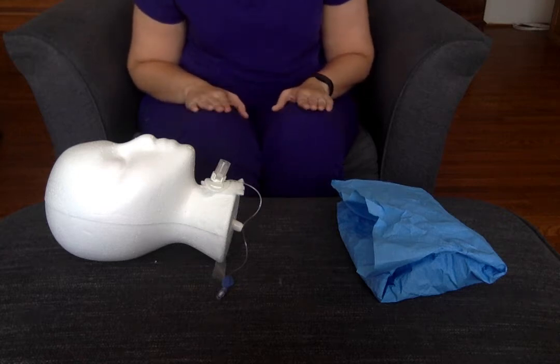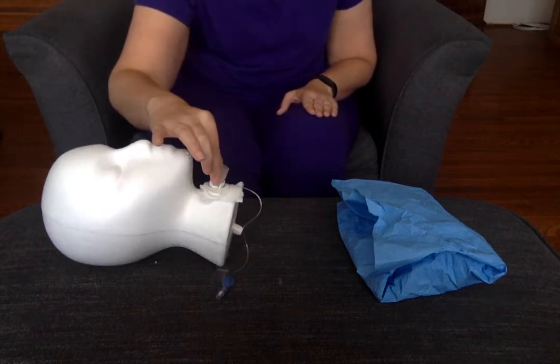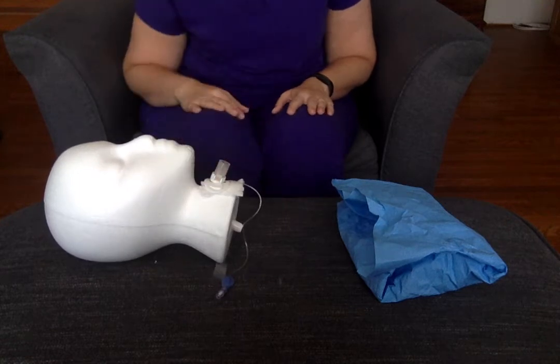Hi guys, it's Professor Sears. I'm going to go ahead and show you how to change out the inner cannula and put a new one in.